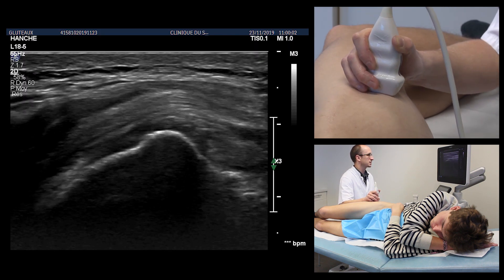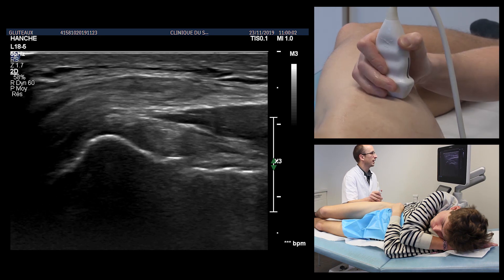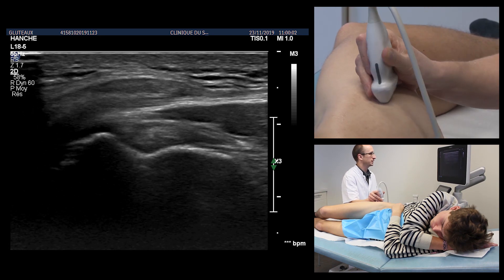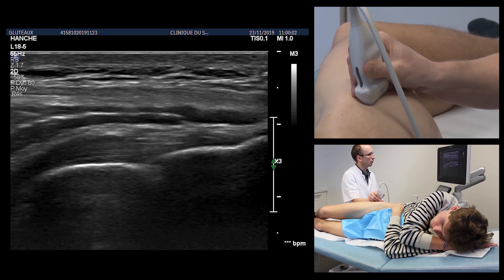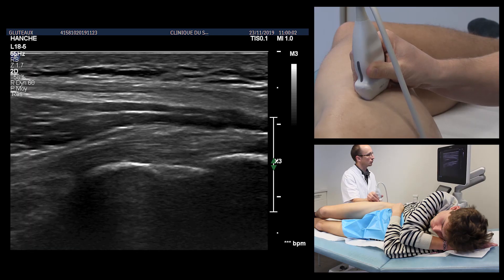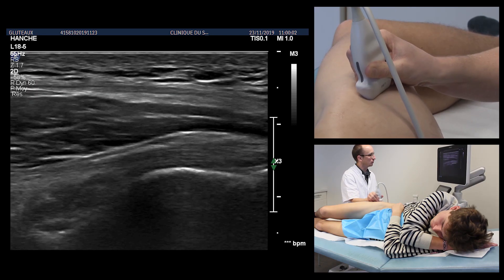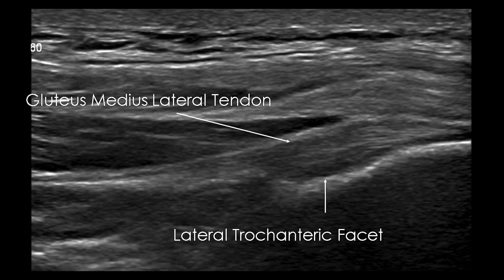On the anterior facet is inserted the tendon of the gluteus minimus. An anterior vertical oblique rotation of the probe is performed in order to visualize the tendon over its entire height.